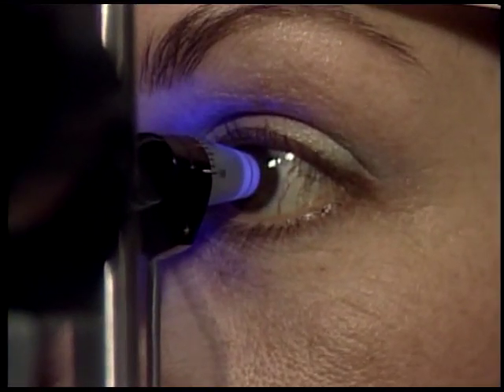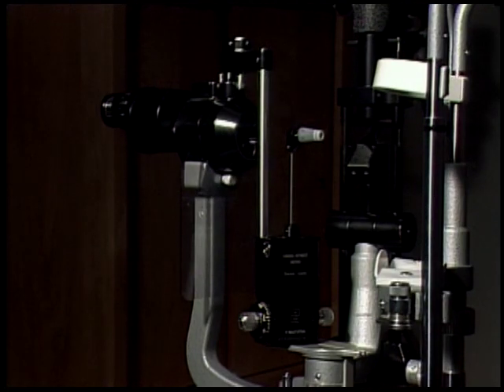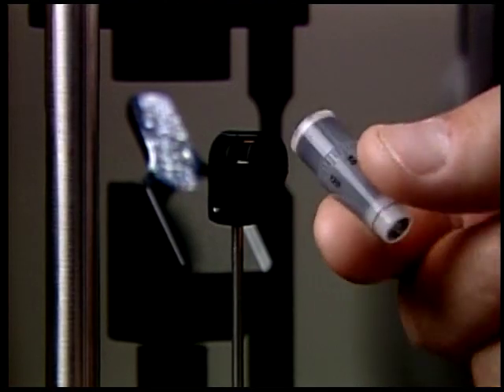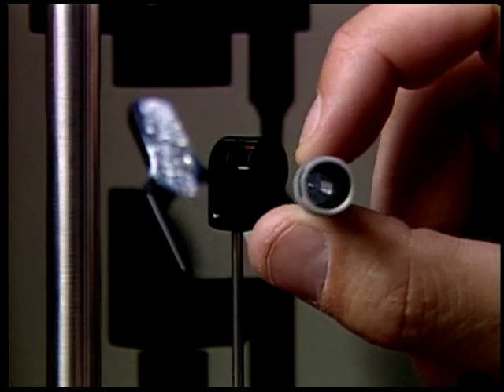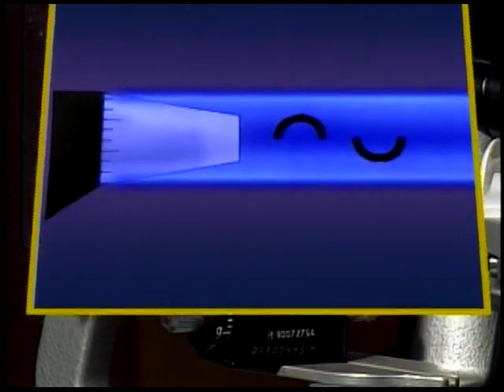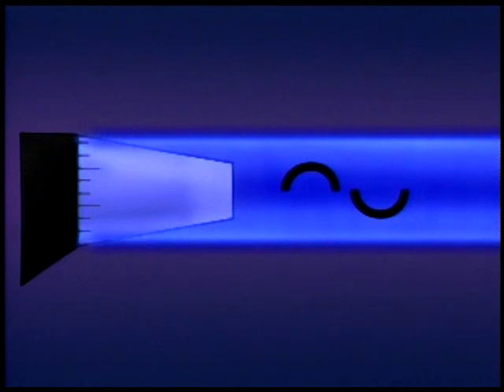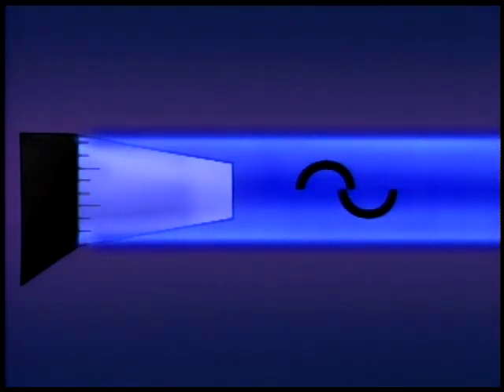which others are compared. It is attached to the slit lamp biomicroscope and consists of an applanating replaceable tip containing a plastic biprism, attached by a rod to the housing piece inside, which contains a coil spring and series of levers that are used to adjust the force of the biprism against the cornea. Two beam-splitting prisms within the applanating unit optically convert the circular area of corneal contact into two semicircles.